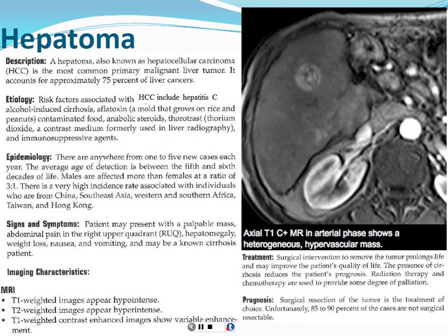So where I trained, our technologists would always warn the patient and let them know it's very important that you hold your breath for this, and warn them that you may feel short of breath. We want to get really good arterial phase imaging, because without that part of it, it's really hard to figure out exactly what it is in the end. So that's one way that you guys can really help out the radiologist, in just preparing the patient for that, in case it occurs.